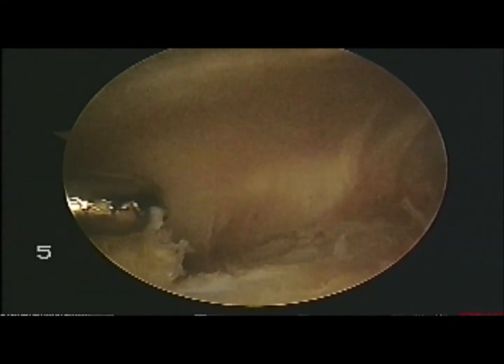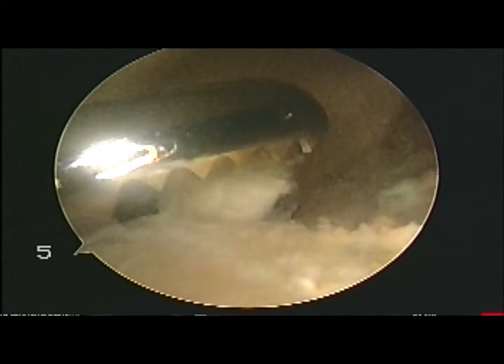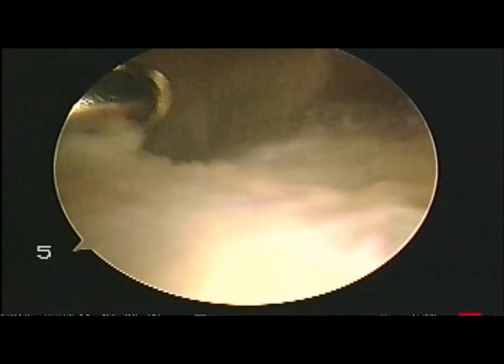This is where the shaver comes into its own. The shaver is very efficient at removing larger volumes of tissue quickly and accurately, as long as you have the ArthroCare Ambient to seal the vessels afterwards.